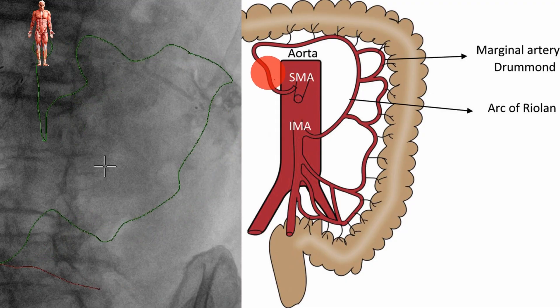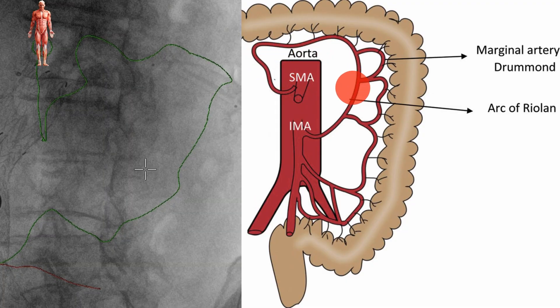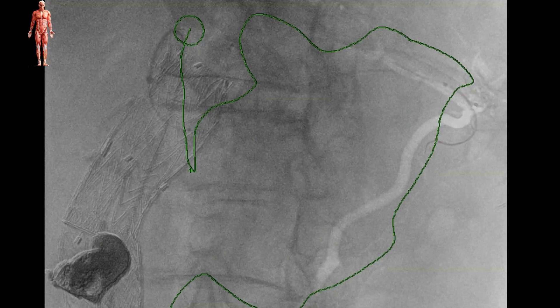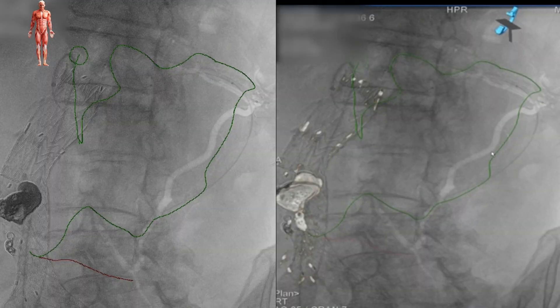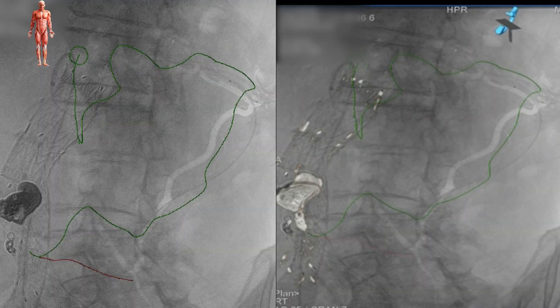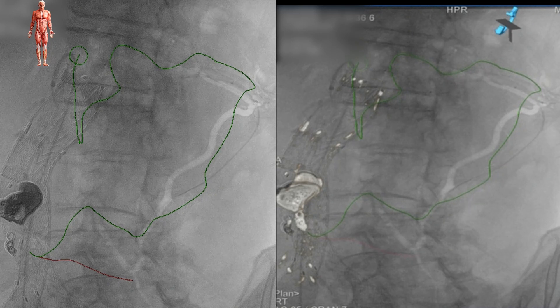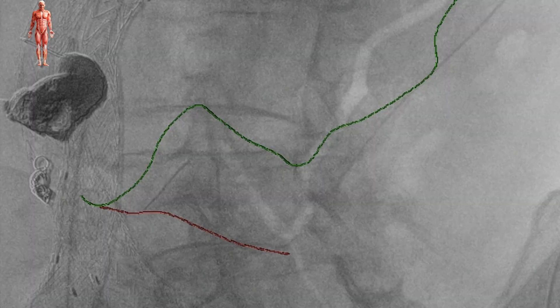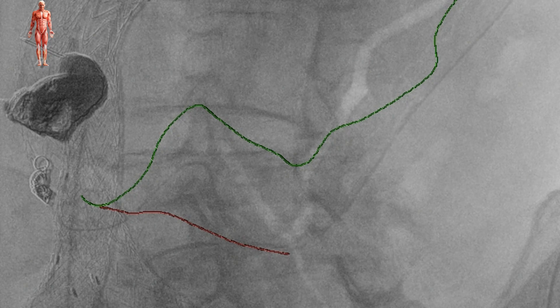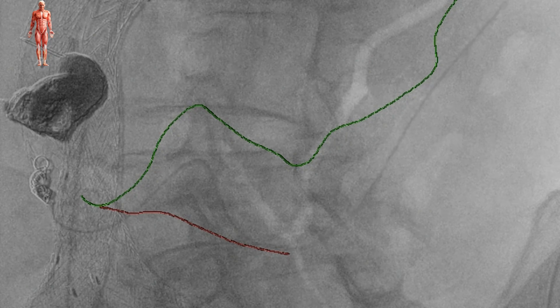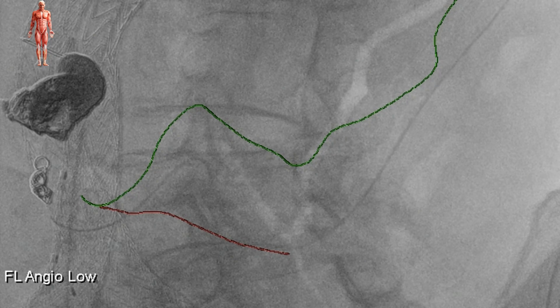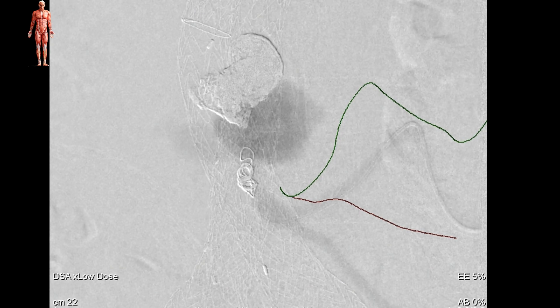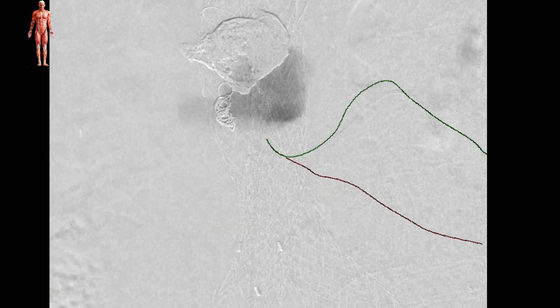Here we can appreciate the whole arch of Riolan connecting the SMA to the IMA, marked with a green line on the left panel. We then finished passing our wire and catheter to the origin of the IMA. We performed an angiography to confirm the location and flow in the endoleak.